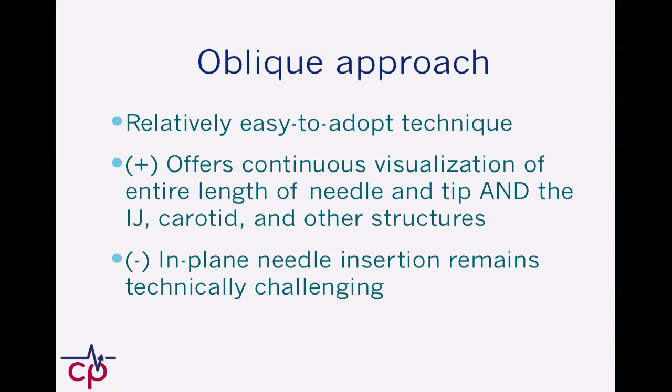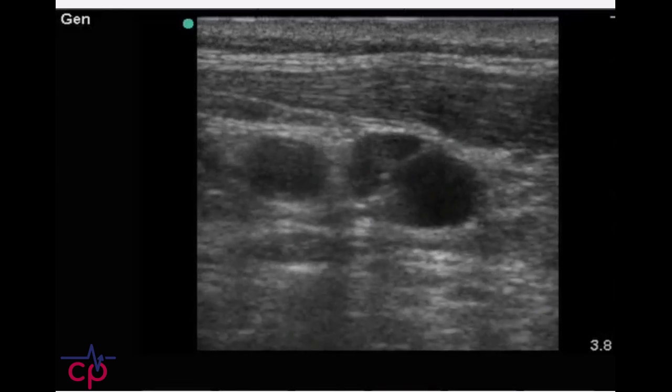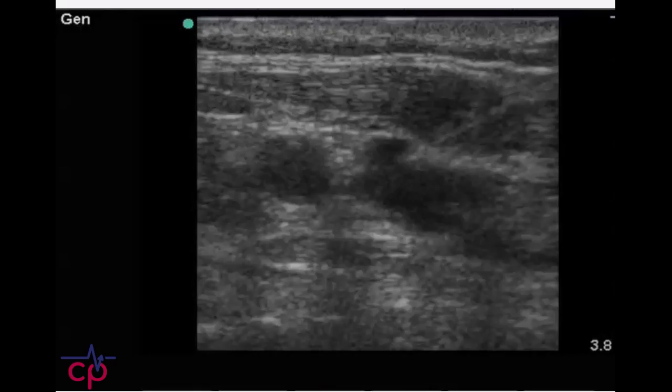I think it's a fantastic approach. In summary, it's relatively easy to adopt. The clear advantage is that it offers continuous visualization of the entire length of the needle and seeing all the structures you need to see. The challenge remains that you have to be very rigorous about staying in-plane with the probe during needle insertion. I hope you guys get some good experience with this and give it a try — I think it's a great technique to adopt. Thanks.